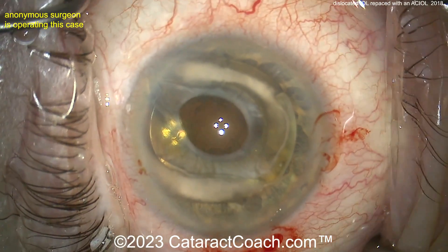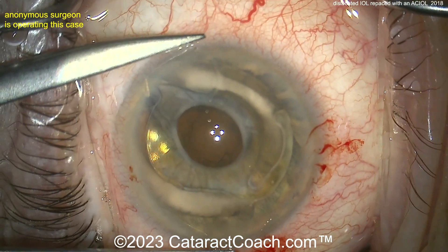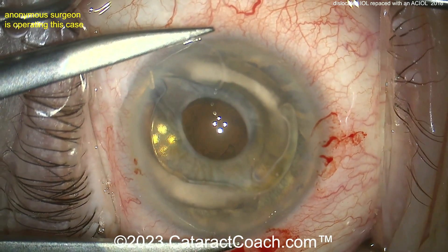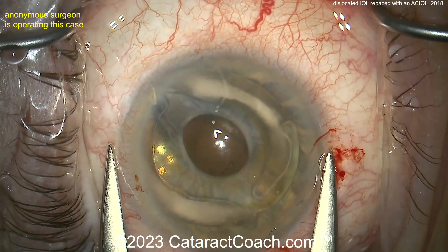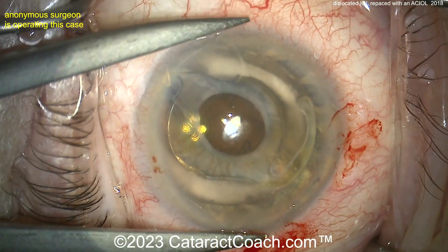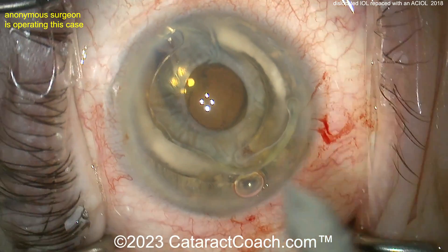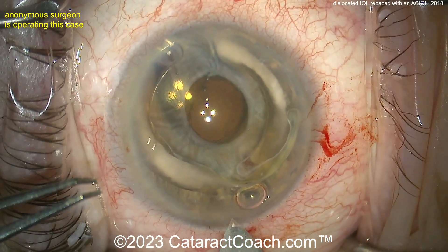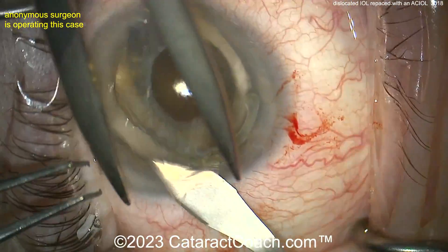Now explanting it. You can do our twist-and-out technique to explant it, but if you're going to put an AC lens in, you'll probably want to make an incision. Now measuring white-to-white, because you're going to use that to help guide the sizing for the AC lens. Remember, AC lenses come in not only different dioptric powers but also different physical sizes.